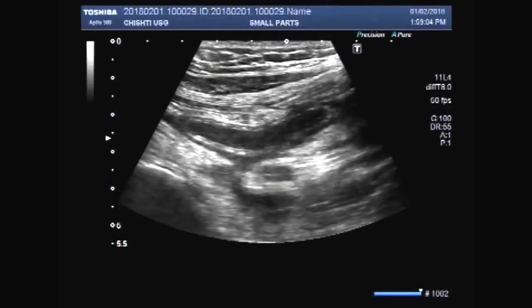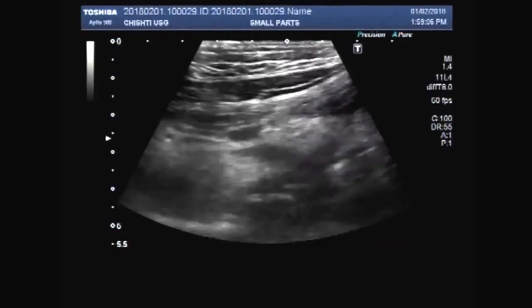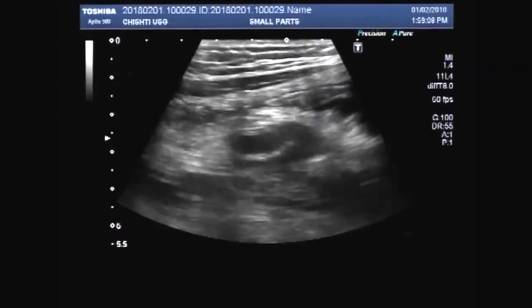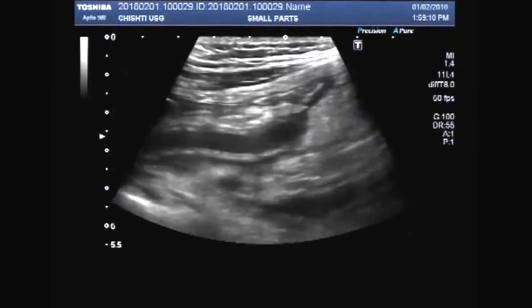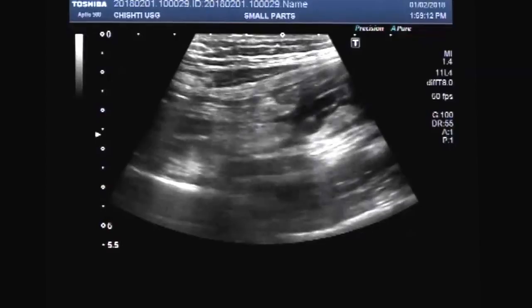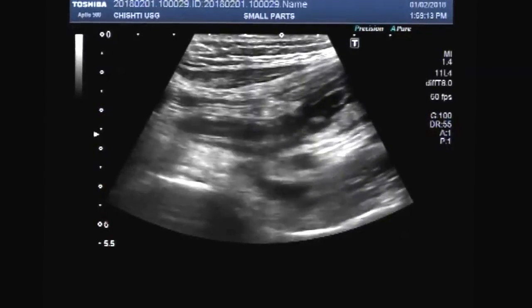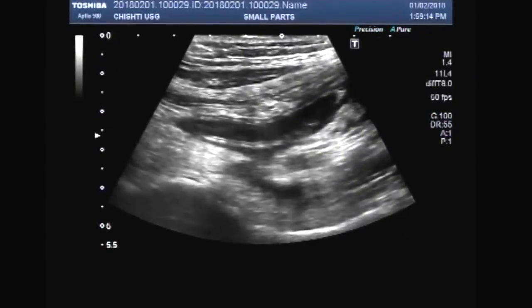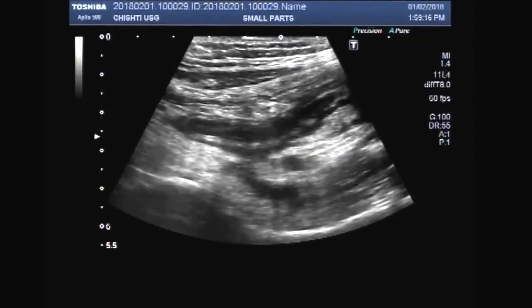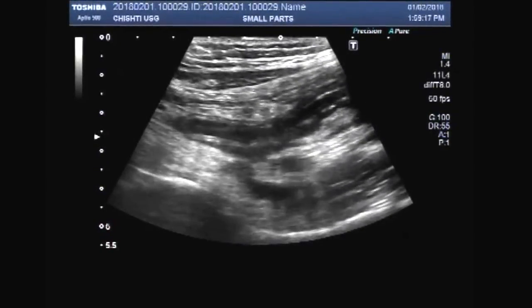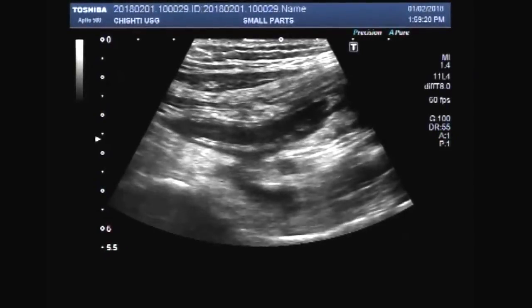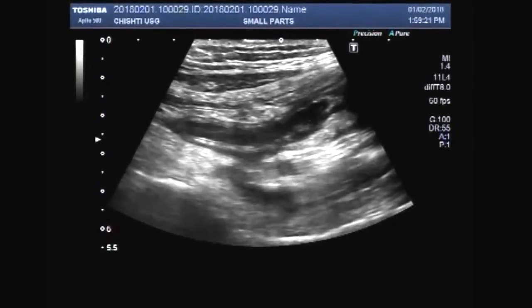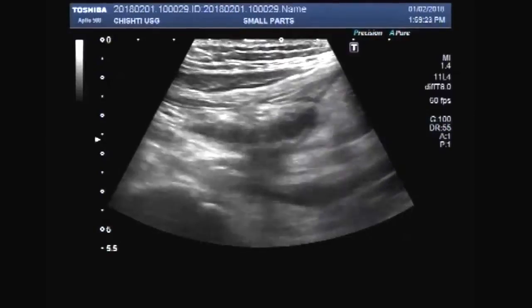Dear viewers, I hope you are all fine. This ultrasound video shows a patient having acute appendicitis. You can see the inflamed appendix in the right iliac fossa.